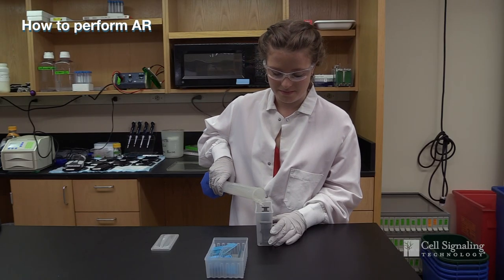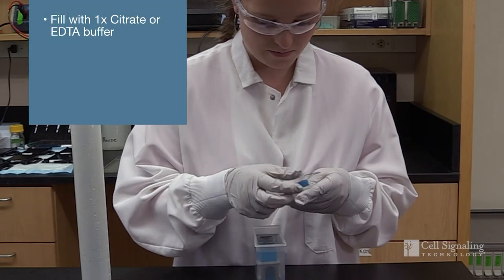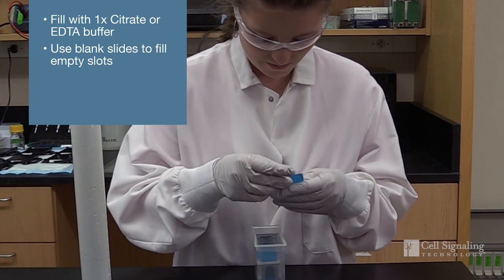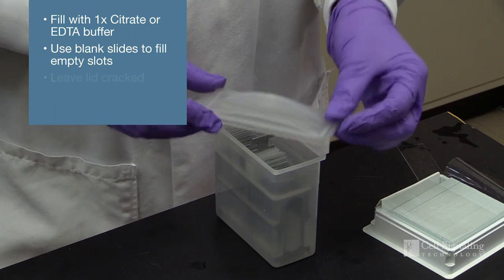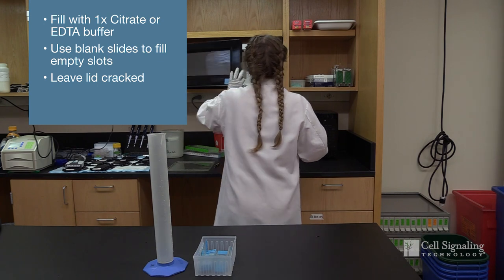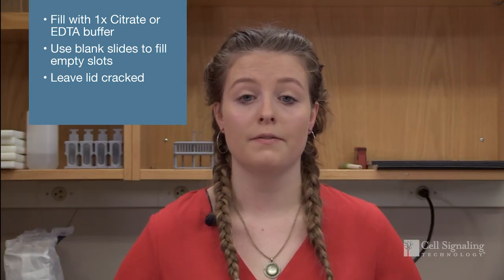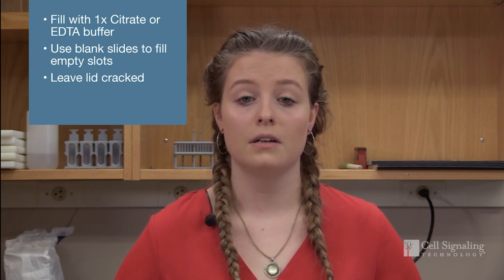Make your 1x citrate or EDTA and fill your container with 250 mL of that buffer. Fill any empty slots in your slide holders with blank slides. This will ensure that the buffer and heat distribution is consistent between experiments. Leave the lid slightly cracked to allow pressure to escape, as this ensures the buffer does not boil over and expose the top of your slides. Also, overheating slides can cause a loss of buffer, which may result in tissues drying out. This can yield false negative results.